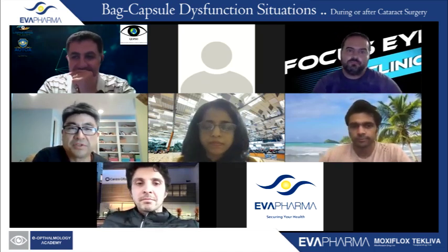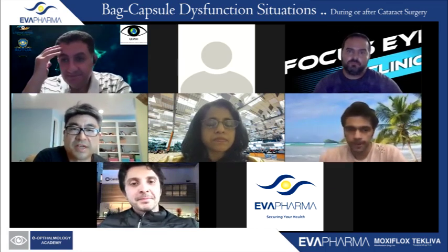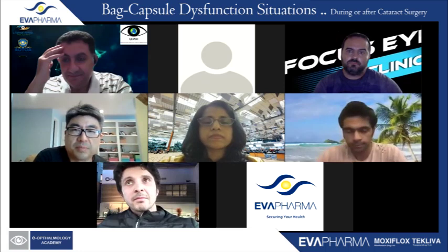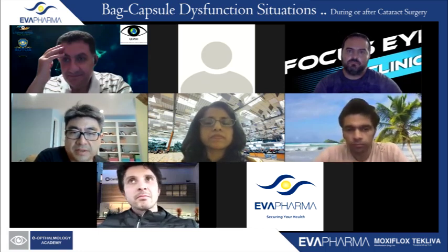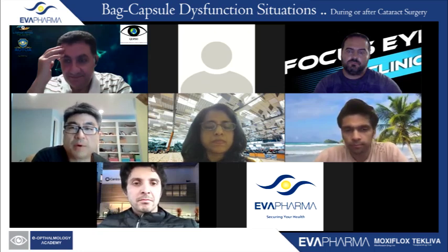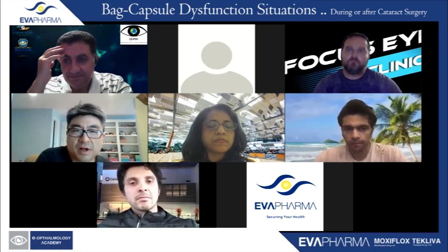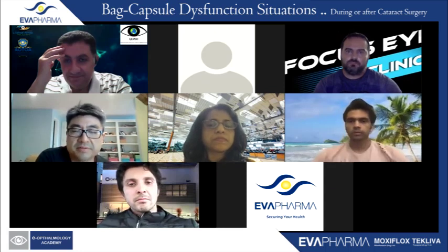I agree. If I was in your shoes, it would be a challenge to do this technique without the PVDF (polyvinylidene fluoride) haptic lenses. And so if I was in your situation, I would be doing glued IOL all day long if it was me.